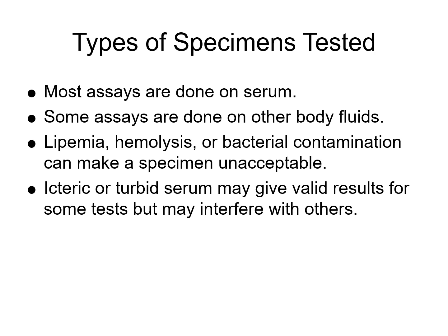For specimen acceptability, unacceptable specimens: specimens that are lipemic or high in fat content, hemolyzed specimens, the ones that have the ruptured red blood cells, and ones that are bacterially contaminated could all be compromised, and that could compromise your assay accuracy and should not be used.